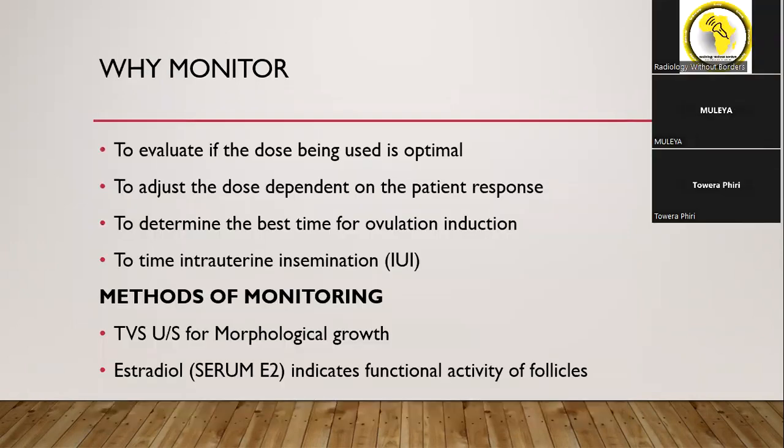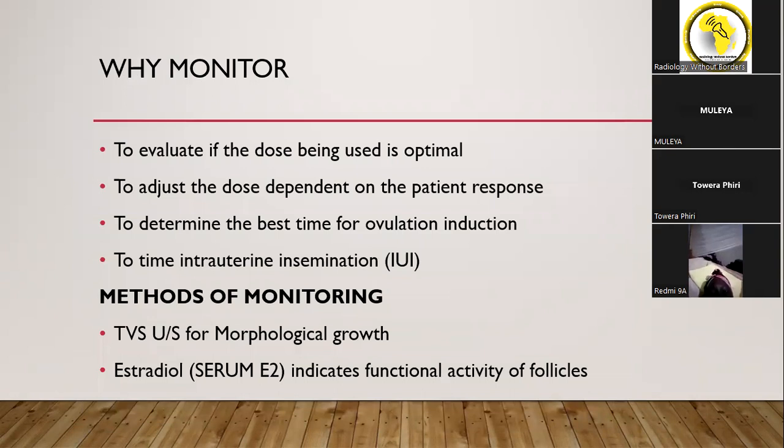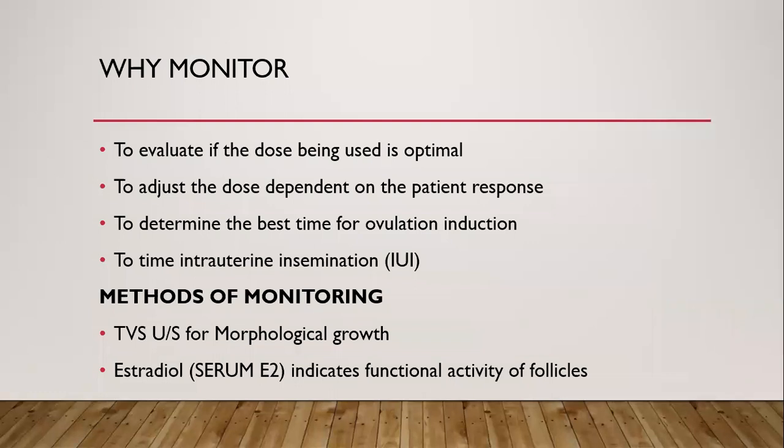So question, why do we need to monitor the follicles? We need to monitor these follicles in order to find the optimal dose for the hormones that they are using to stimulate the ovaries. Equally, if the dose that is being used is not okay, they need to adjust it.